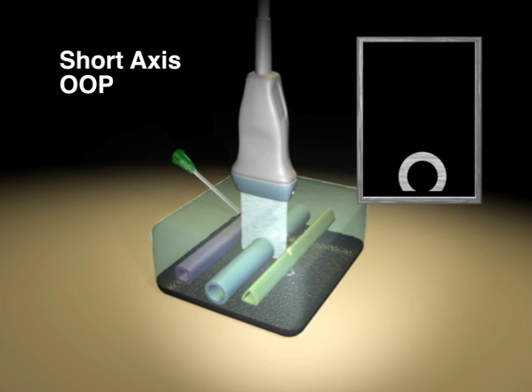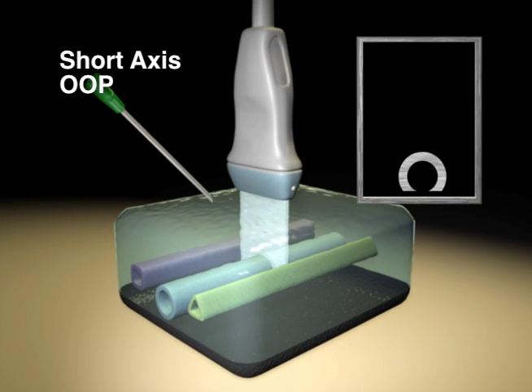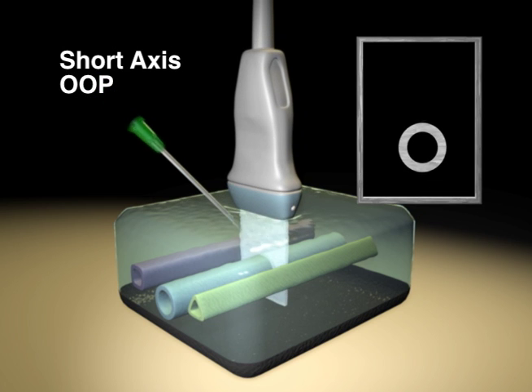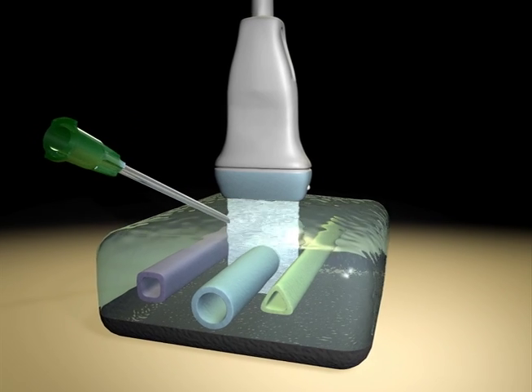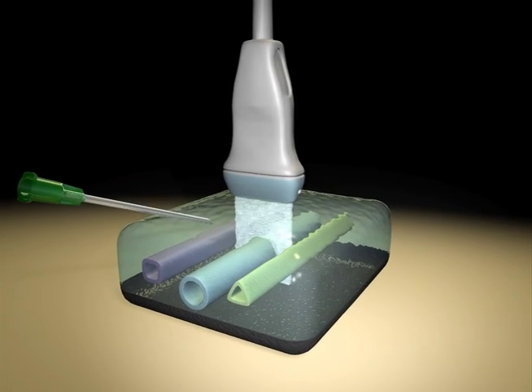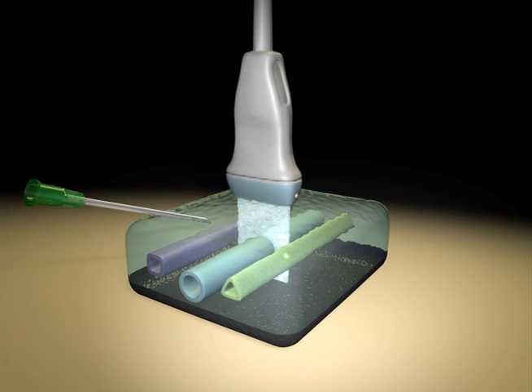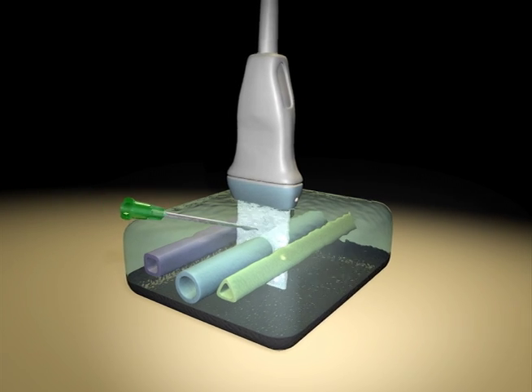This simulation shows a cylindrical structure imaged on short axis. The needle enters from outside the scan plane at the midpoint of the transducer and advances toward the plane of imaging, where it will appear as a hyperechoic dot. Tilting the transducer can be used to locate the needle tip and guide it into the vessel.